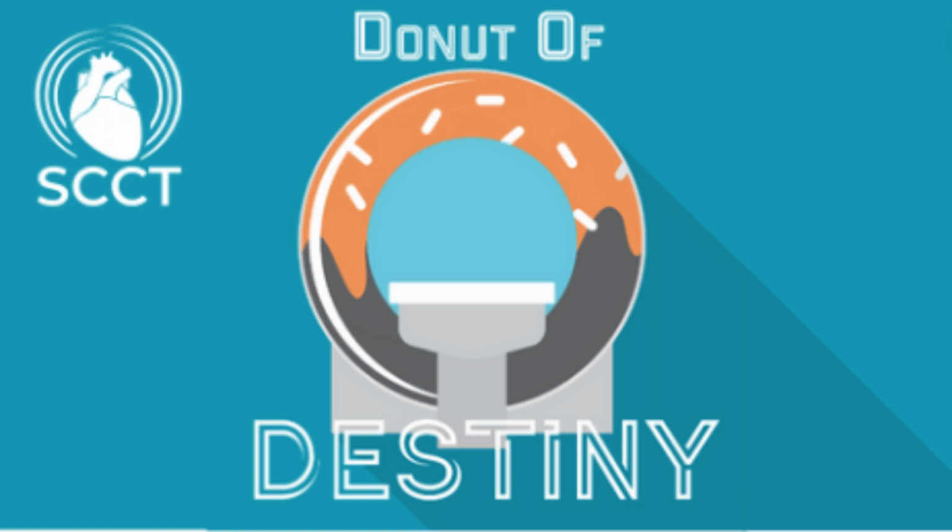Okay, that's super helpful. And I'd like to emphasize that one more time. The window of time where the heart is relatively quiescent at the end of systole, beginning of diastole, is less than 120 milliseconds. So equipment on the market that has a temporal resolution of 120 milliseconds or greater will likely not be able to capture motion-free pictures at end systole. Therefore, to get motion-free pictures at end systole, you need equipment that has temporal resolution of less than 120 milliseconds. For example, modern-day dual-source scanners.